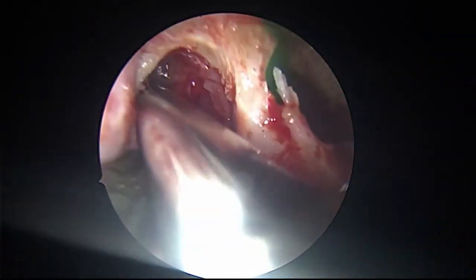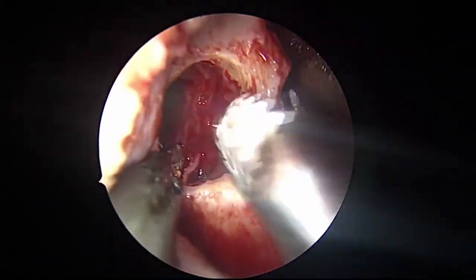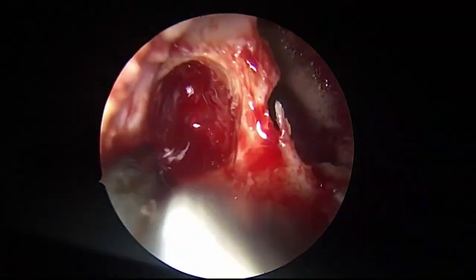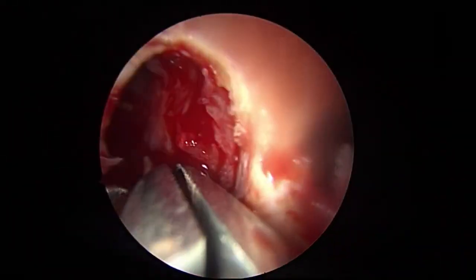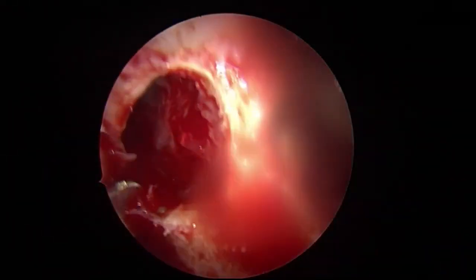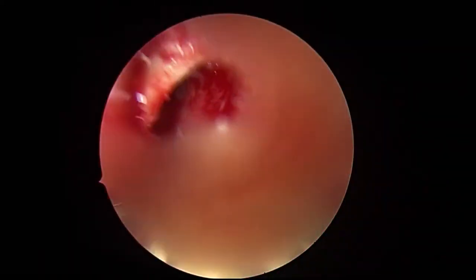What you have to define is the interior of the maxillary sinus and the level of the roof. See, very clear? Now I will define the cavity better by going a little bit more laterally. Let me decongest from inside.